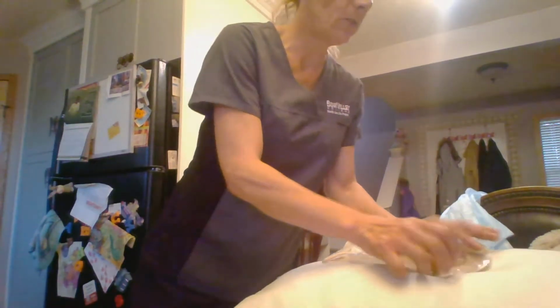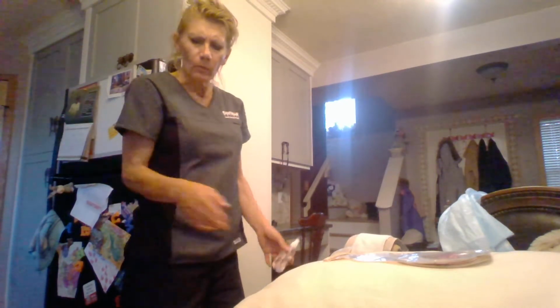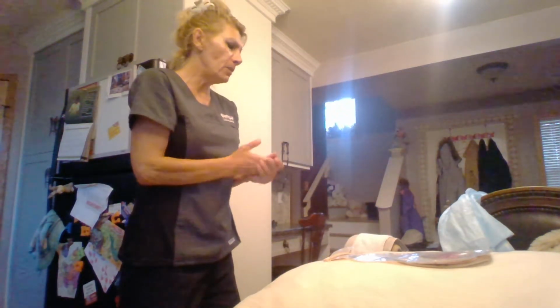Actually, I have to put that system back on because I don't have another one, so we'll pretend that we'll put that back on. You've got all your supplies. You brought your gloves. You brought your disposable waste baskets. You brought the water with a temperature of 40.5 to 42.7.